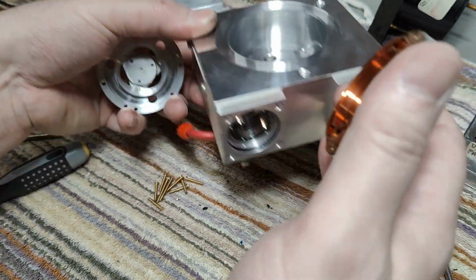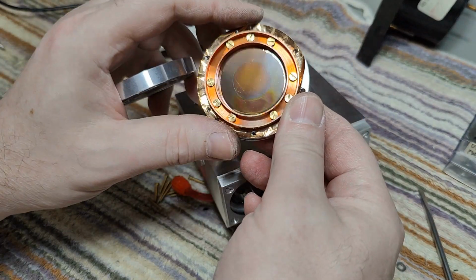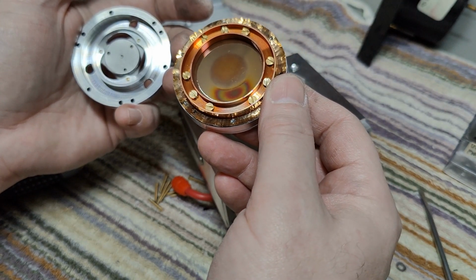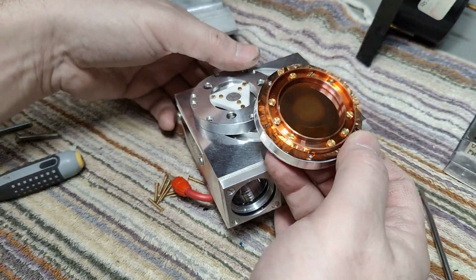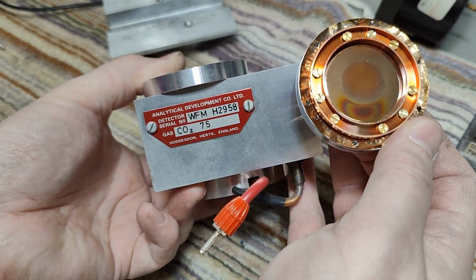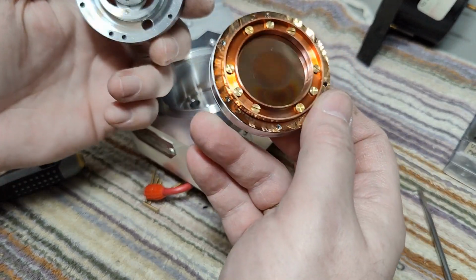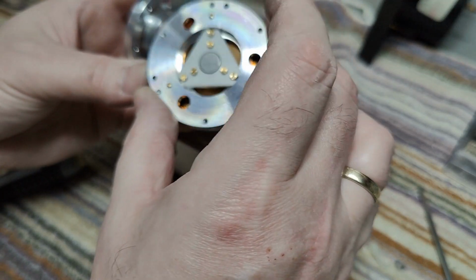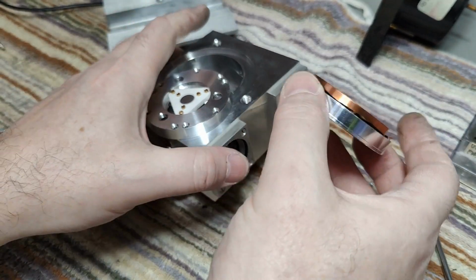But I think that concludes this video. I hope you learned something, or at least probably right now you're just as confused as I am, and I really want to go now Google all this and see if I can figure out what the heck is going on. And here is the detector thingy, whatever. And then I can't wait for the first to comment, hey, it's doing this and that, and it's so and so, whatever it is. But definitely some sort of a sensitive microphone thingy here.